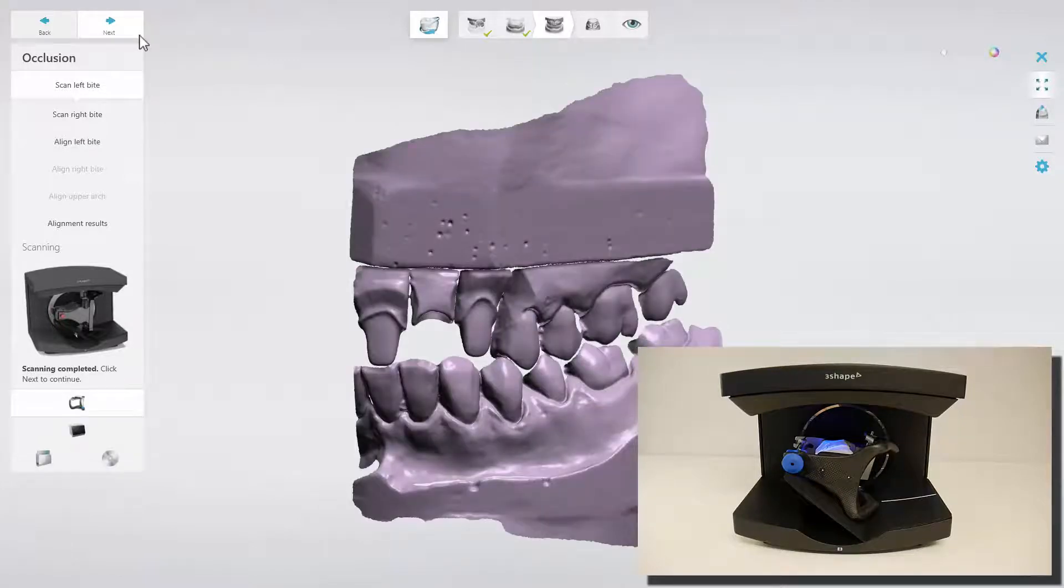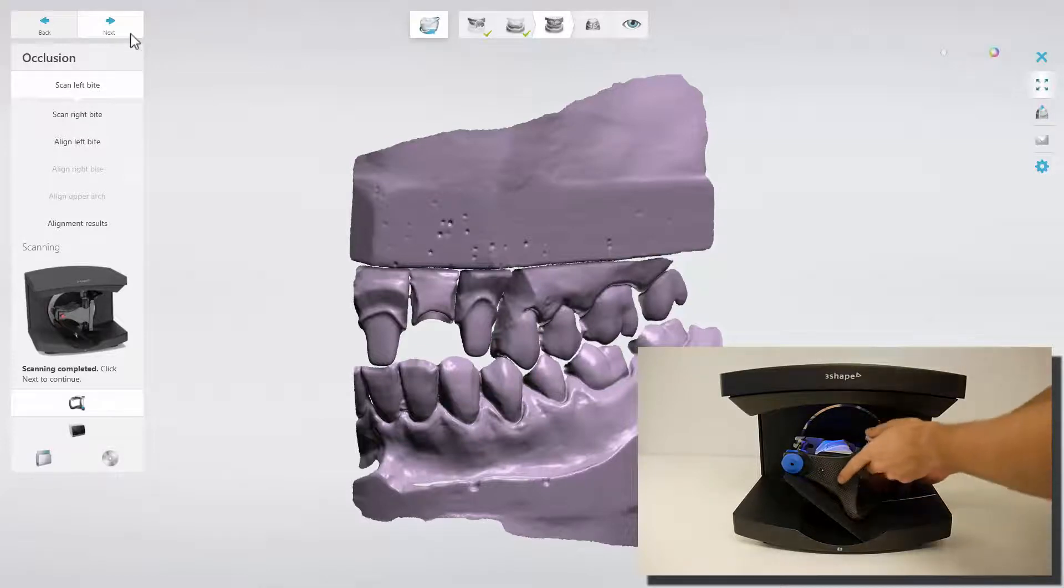After scanning, the left side bite will appear on the screen. The following step is to scan the right side bite.